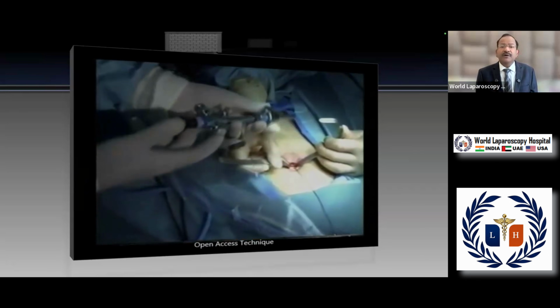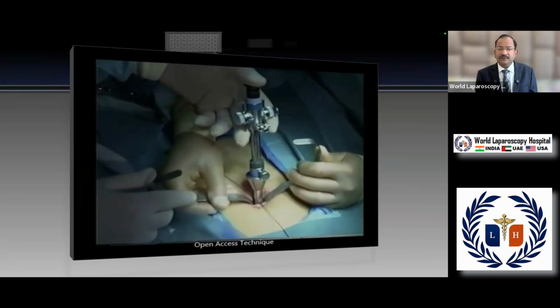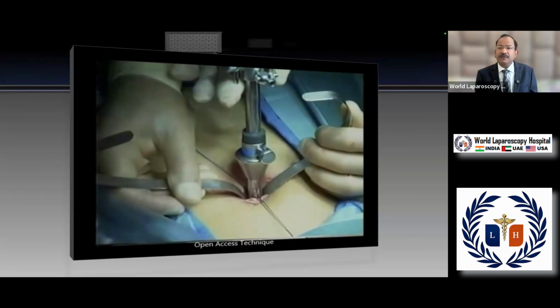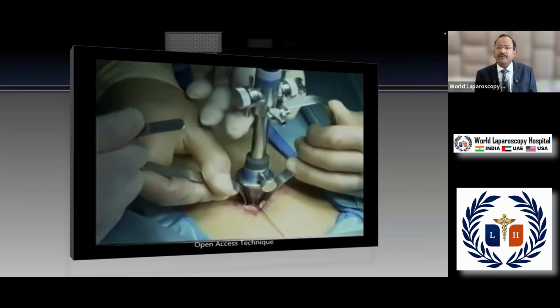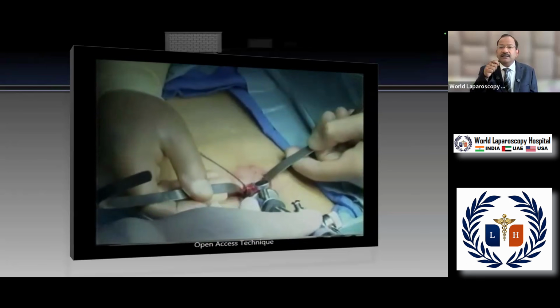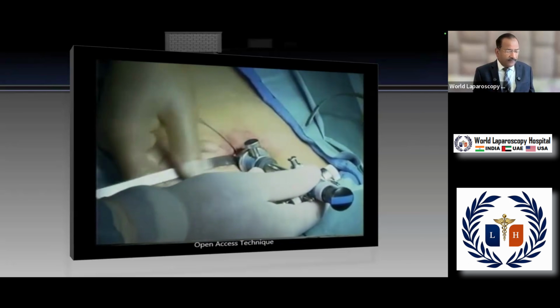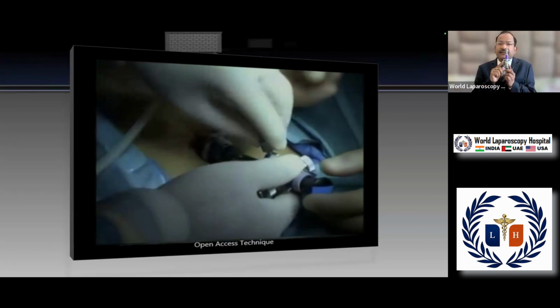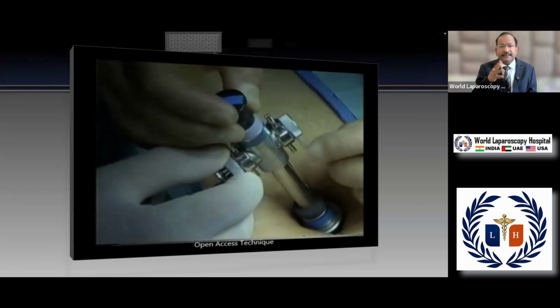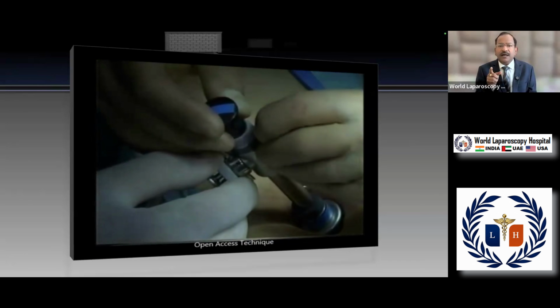And after tightening, you will drop it into the wound, and because the trocar is blunt, there will be no injury. And then these sutures, where the bite was taken on the rectus sheath, you will entangle around the sheath. There is a sheath over the cone here, and you will entangle this. You will not tie a knot, you should just entangle, and that's all, because at the end of the surgery, this suture is used for the port closure.